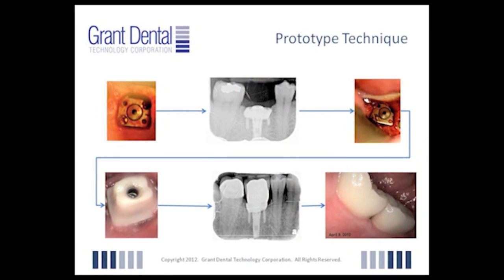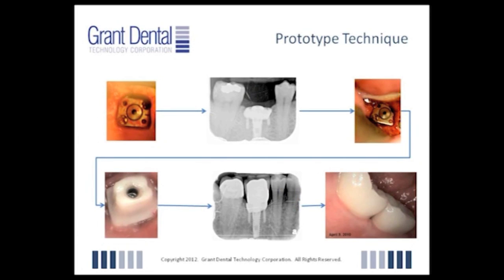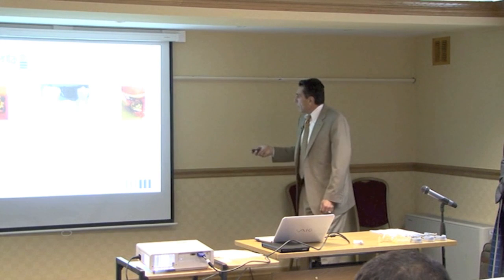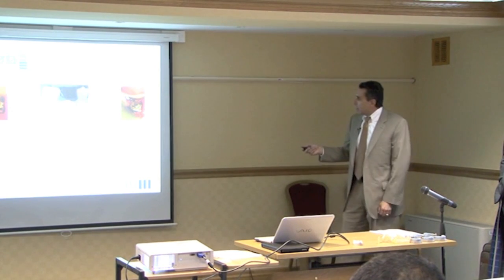And then we put a small, you can see that round, we just took the off-the-market flat cover screw and put it on top of the implant. And this is what we were left with. And this is what it would look like after we finished the surgery. So you can see, here are our little retention screws, here's our implant going through, the AstroSpeed, and the flat cover abutment.